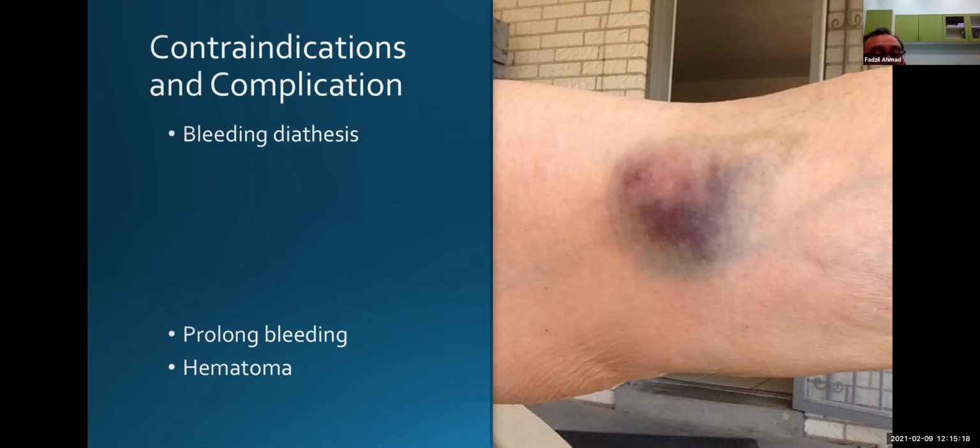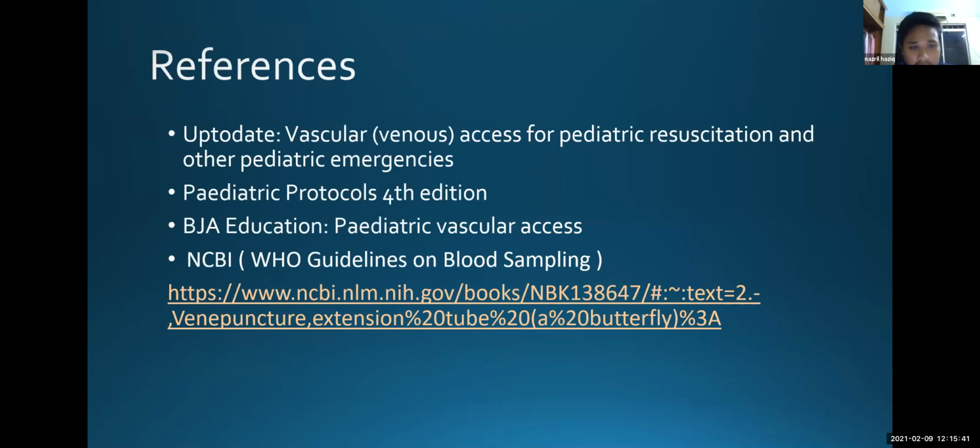Kalau kita perlu ambil, kita kena perlu ambil lah. Cuma kita tekan lama. Ini biasanya hematoma ni because you tak tekan lama. Kalau budak orang tu ada bleeding disease, biasanya tekan lama. Bila tekan lama tu prevent the blood clot, hematoma. Okay, okay, that's all. Okay, next.